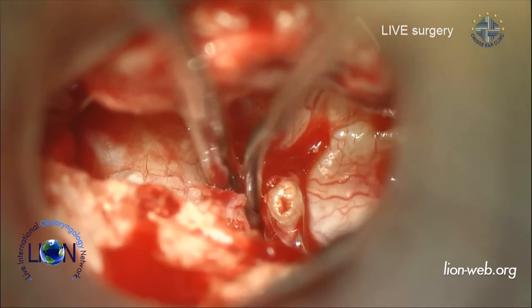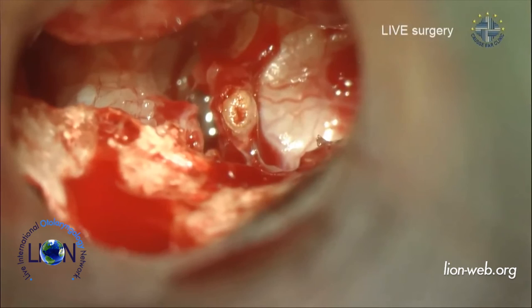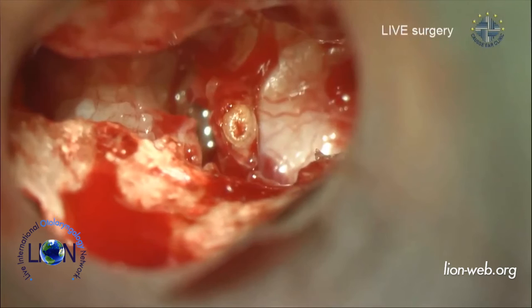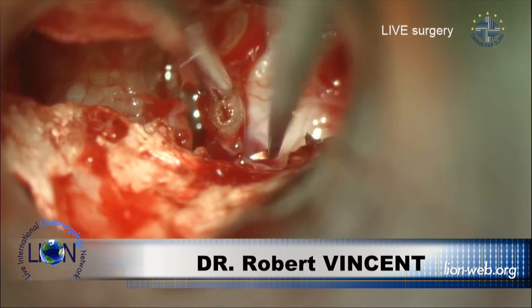This looks fine. No, I think we can try the stapes. See the round window reflex now. Yeah, we can see it. So, I will try the band anyway. Now, there is no stapedius tendon here, but there is some. There is a nice place here for the malleus replacement prosthesis. I will put it on the left, to find a gap here for the band, which now is fine.